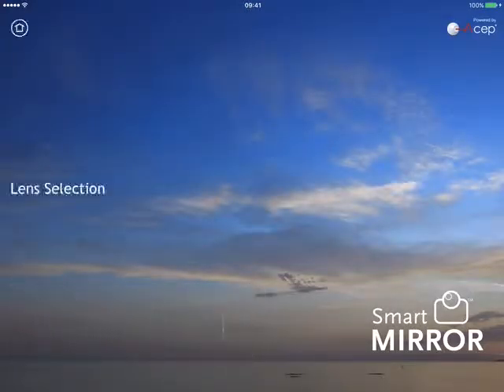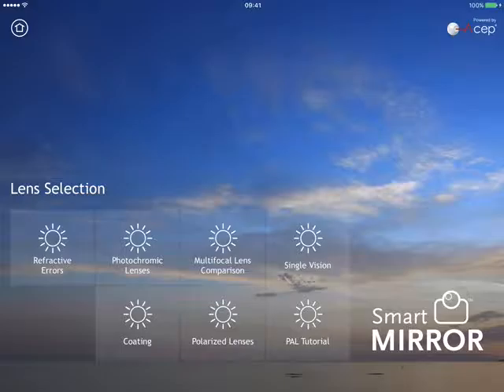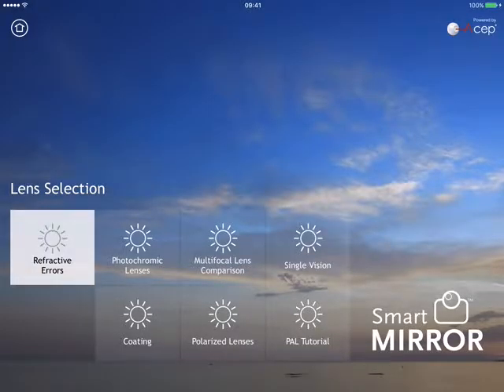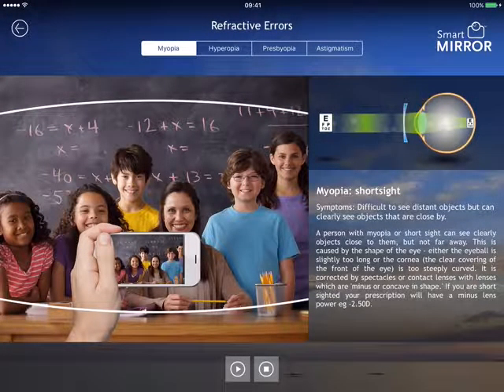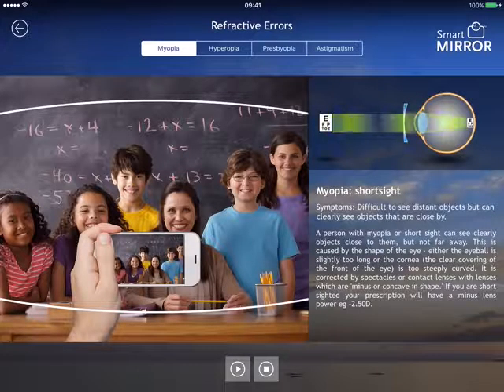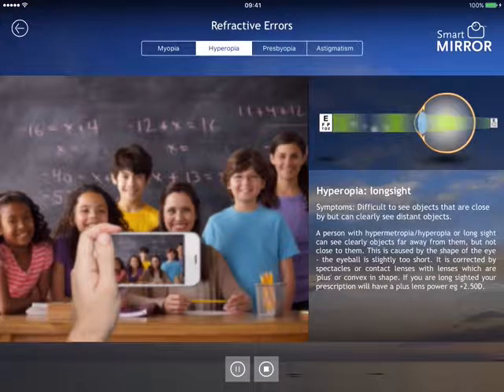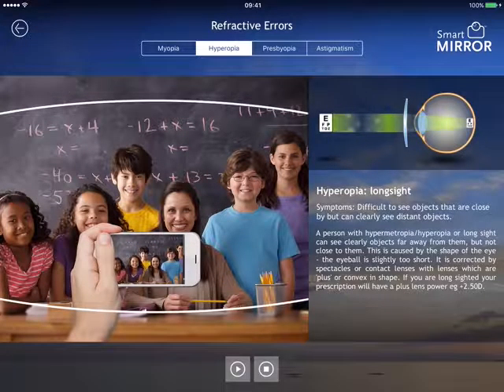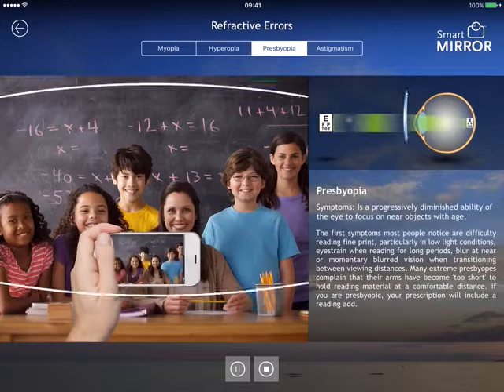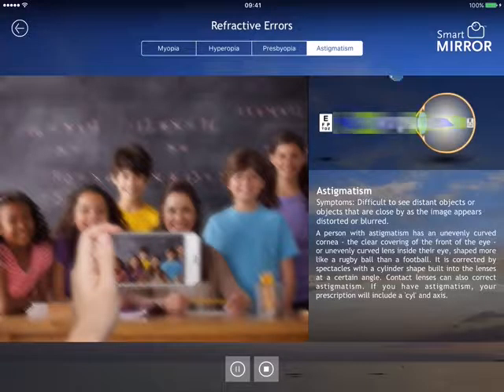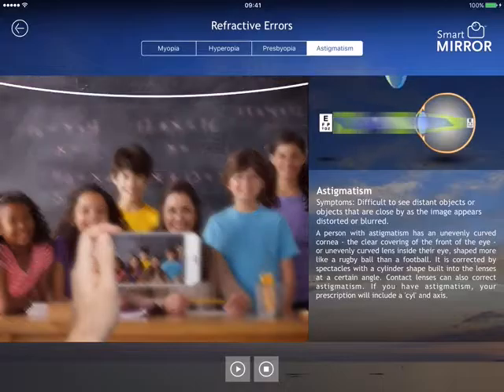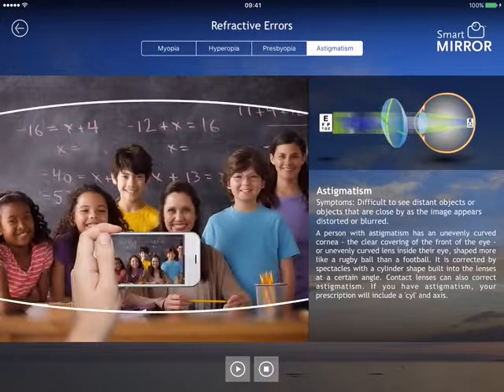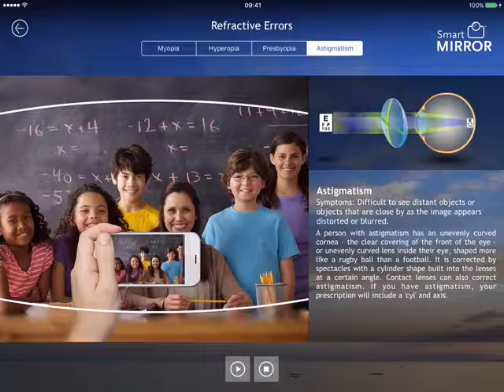You have lens simulation. In lens simulation we have a total of 7 modules, the first being for refractive error. This is a tutorial module that explains to the customer the need for a certain prescription — for example, myopia, hyperopia, presbyopia, and astigmatism. You can also show how these lenses are going to correct vision, so that is something in detail that you can show.